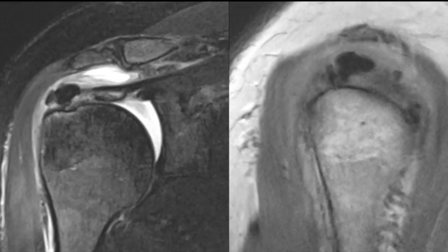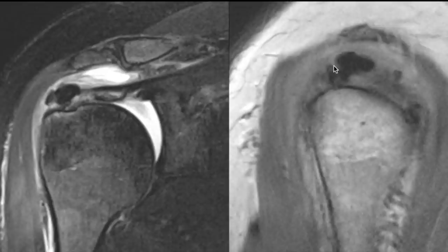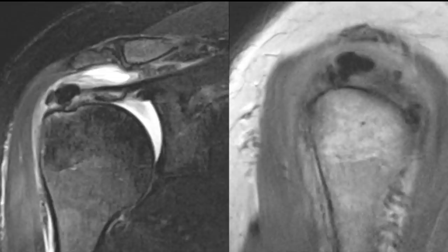Sometimes tendinosis is due to calcification, known as calcific tendinosis. Calcium appears hypointense on all sequences. In one case, calcium is seen at the enthesis of the supraspinatus tendon extending into the subacromial bursa, causing bursal inflammation with thickened bursal lining, fluid in the bursa, and deltoid edema. This represents acute exacerbation of calcific tendinosis or calcific tendinitis. These patients present with a classical history of sudden onset acute pain.